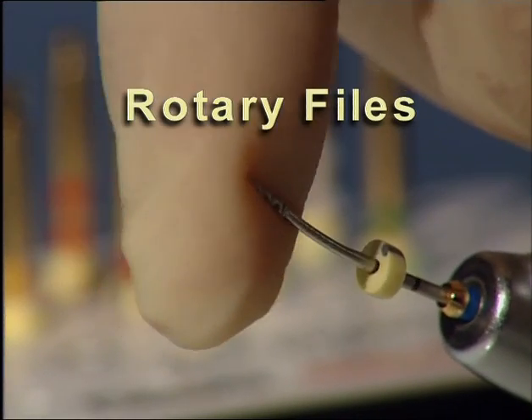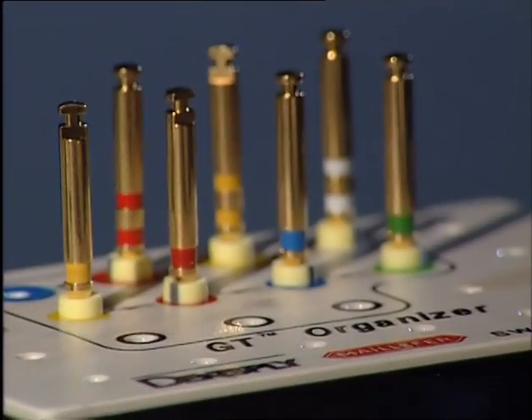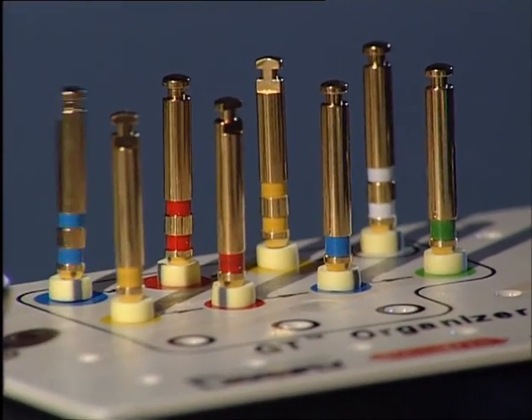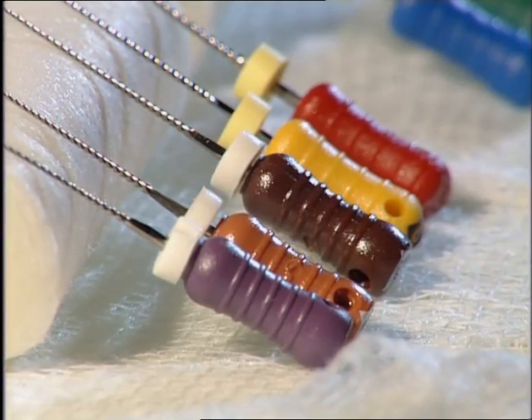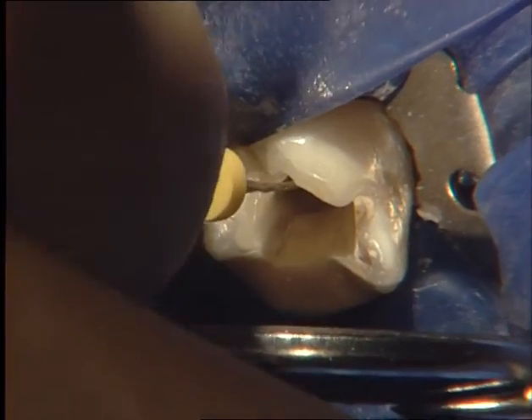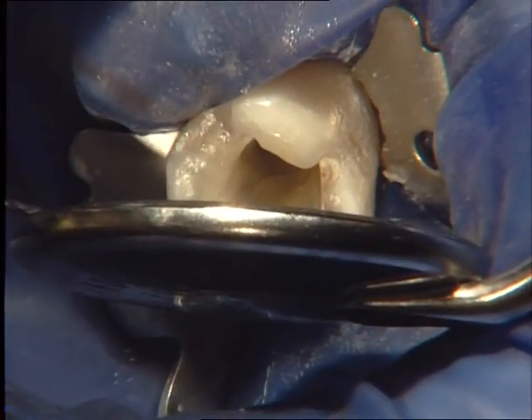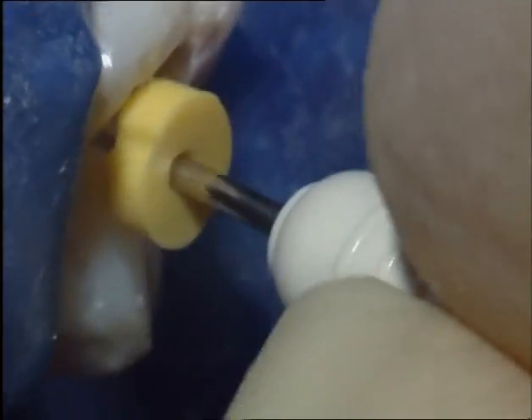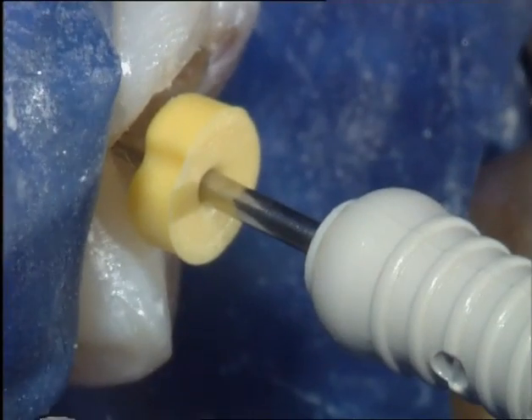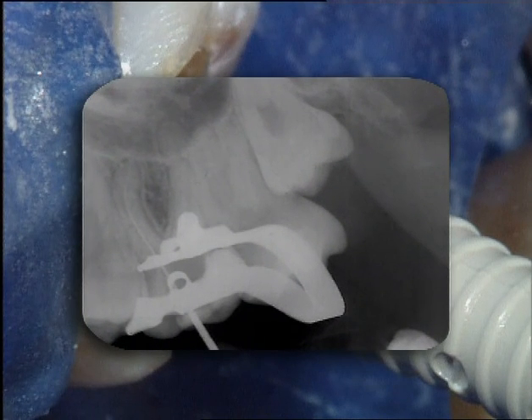Due to their super-elasticity, instruments made of nickel titanium also allow the less trained dentist to shape curved canals without apical blocking or tearing. Nickel titanium can be effectively used as a rotary root canal instrument in moderately curved root canals. Before using rotary nickel titanium instruments, the path to the radiographic terminus should be established with the number 15 file during initial apical preparation. With this instrument, the initial length is controlled.